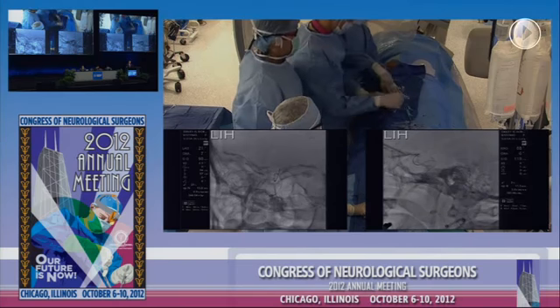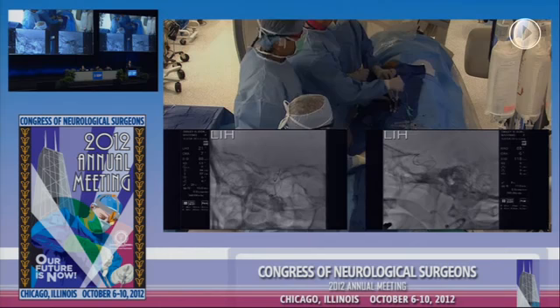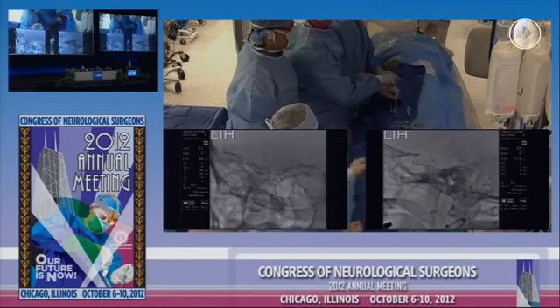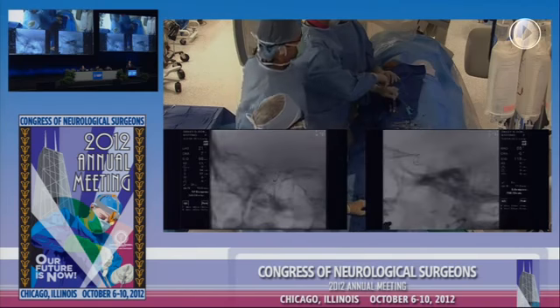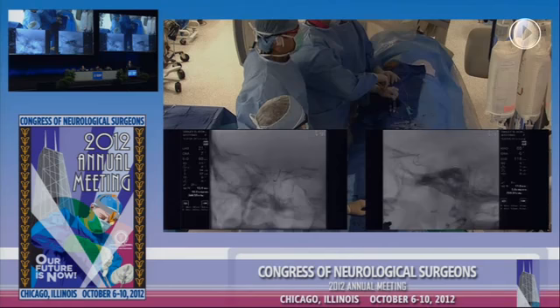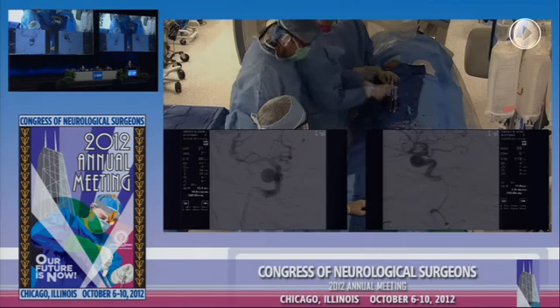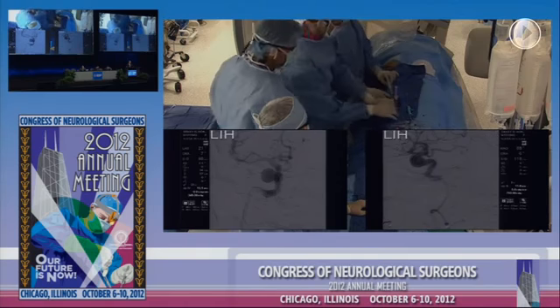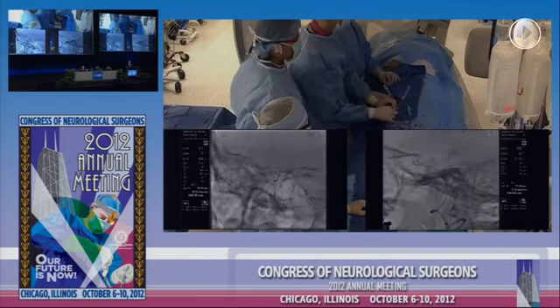Okay. You want a road map now? Road map, please. Bonnie, nice and still now. We're ready with zoom. Go ahead. Hold nice and still now. Okay, go ahead. So we'll wait for that road map to take.